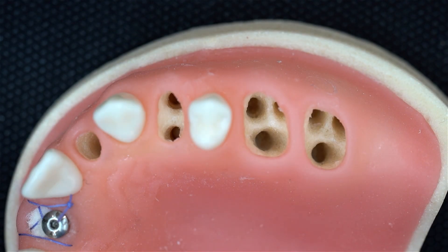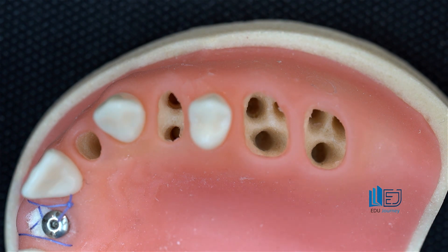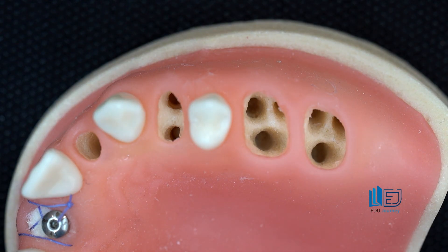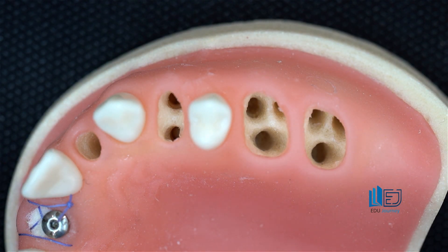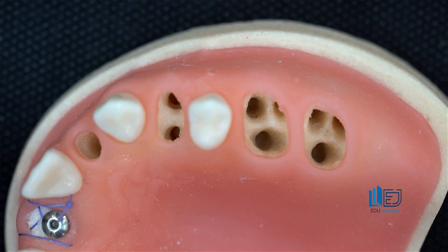To complete the points regarding fresh socket implantation in the posterior regions, an atraumatic extraction — or better yet, a less traumatic extraction — in the posterior areas almost forces me, as the surgeon, to perform the extraction not as a closed procedure, but rather as an open surgical procedure, often involving sectioning of the roots.